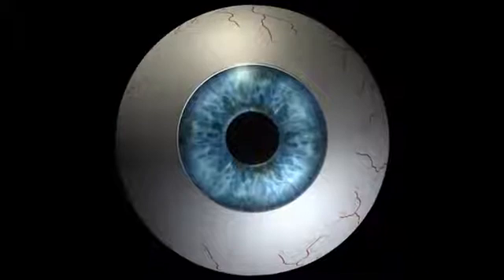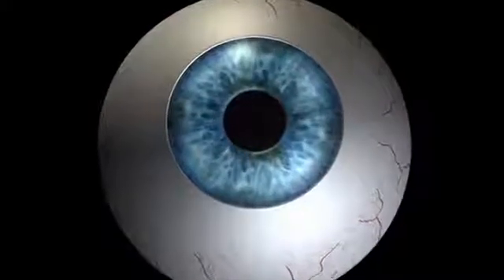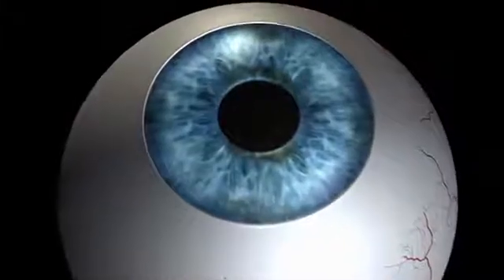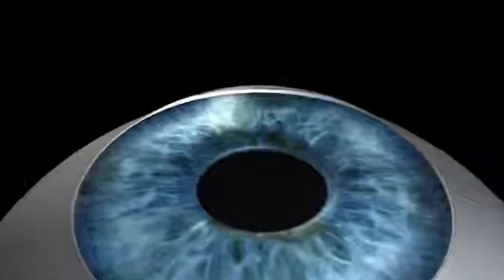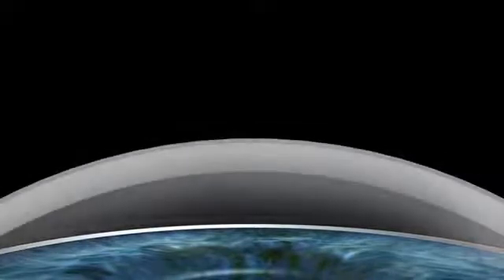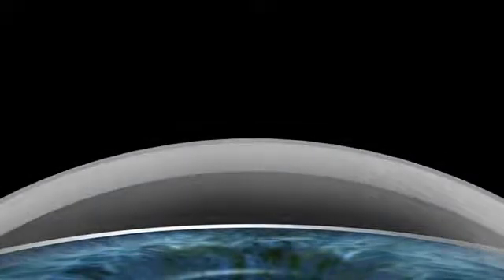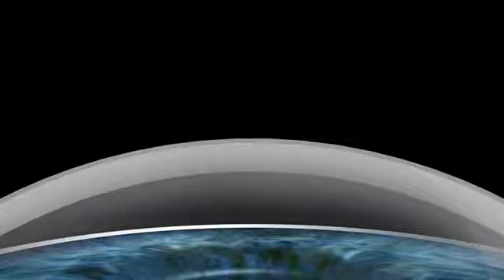TransPRK is a transepithelial single-step treatment that avoids the eye coming into contact with any instrument. TransPRK is an advanced surface laser treatment because the epithelium is removed by the excimer laser more precisely and uniformly than with either manual or alcohol-assisted debridement.